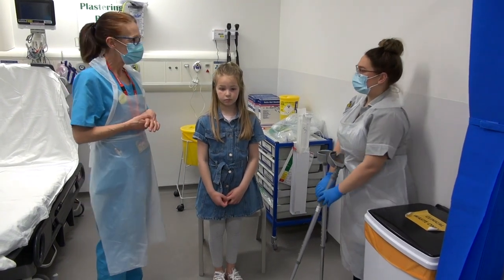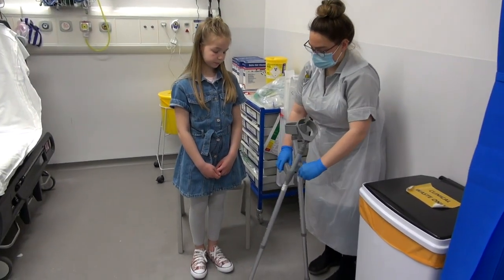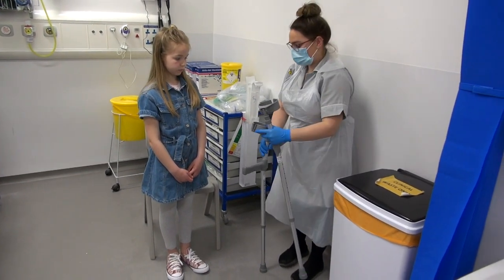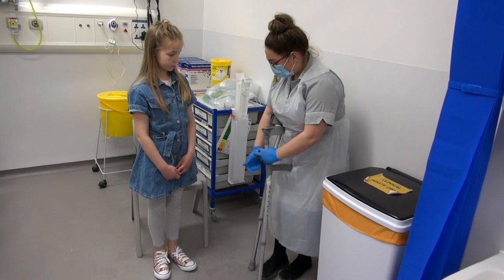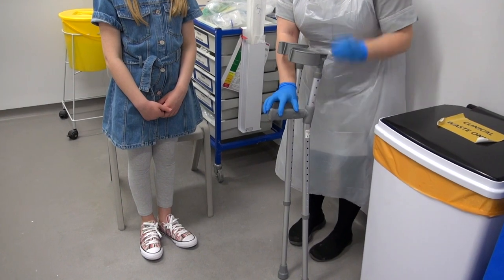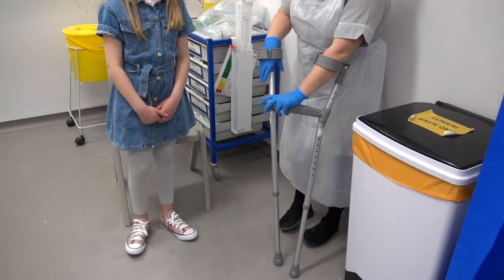Lucy's going to show you how to measure up and how to use them. So you measure up, pop this down the side, and then you just measure up on the wrist — roughly about there. And then I'm just going to demonstrate, and then you can have a go.